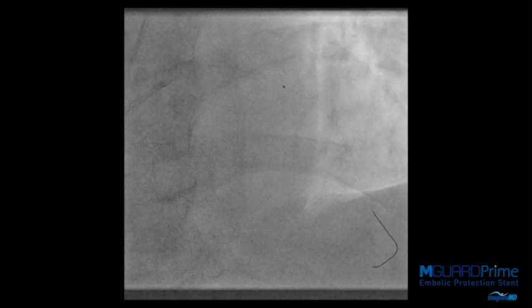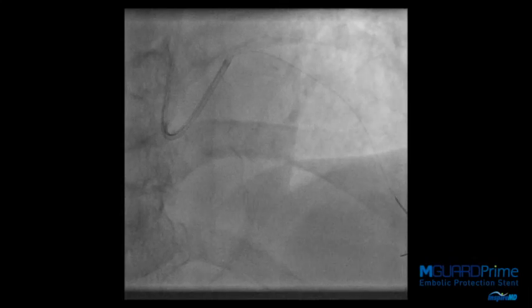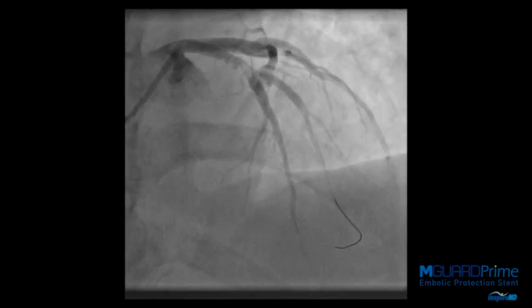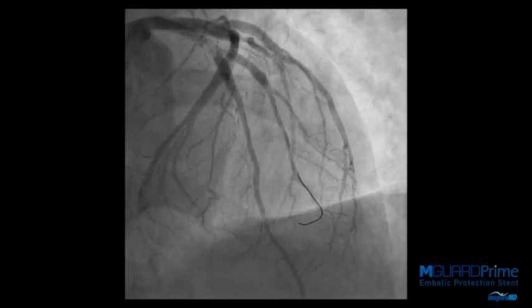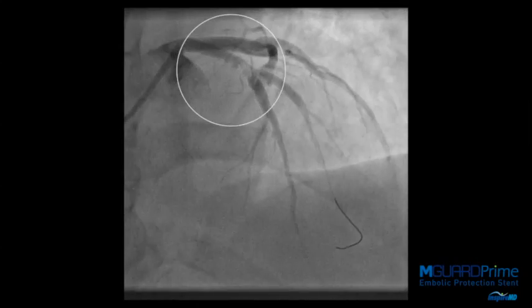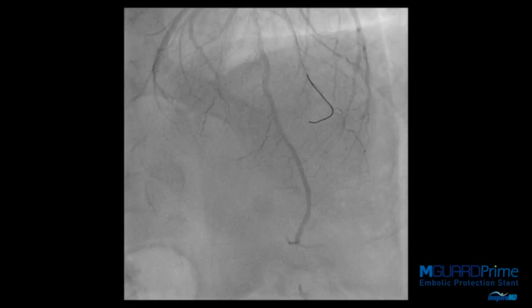Normal practice for a patient with extensive thrombus is thrombectomy, and this is indeed being shown here. This shows that the thrombectomy catheter has indeed extracted some thrombus, and despite that there is a massive thrombus load in the proximal LAD just where a large diagonal artery comes off. More thrombectomy. For these cases, multiple extractions are often necessary.